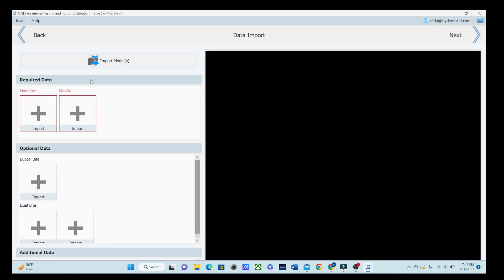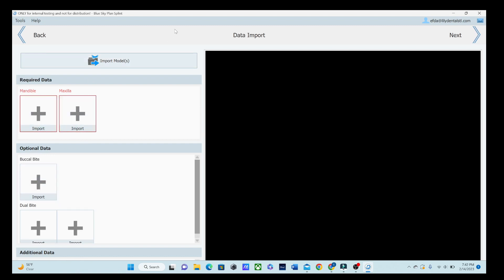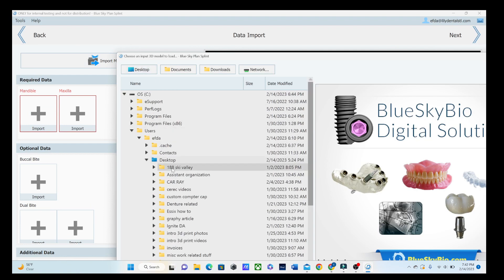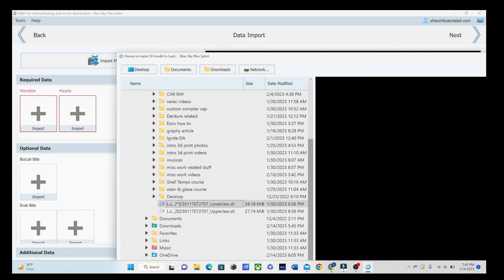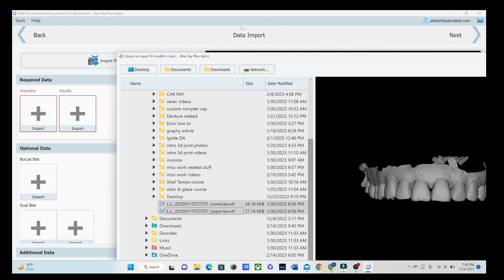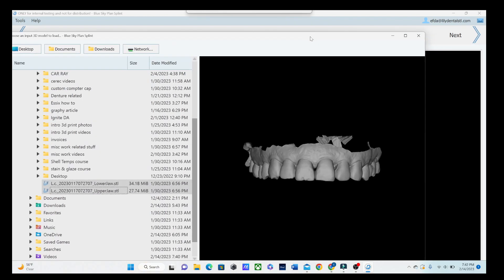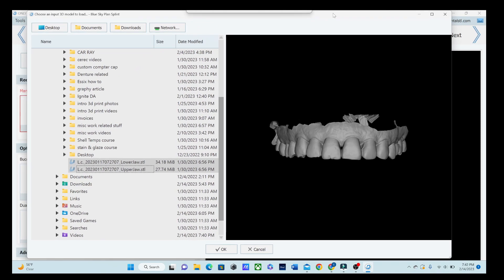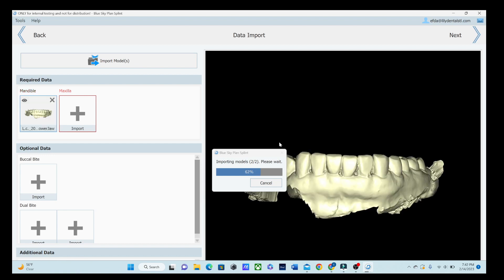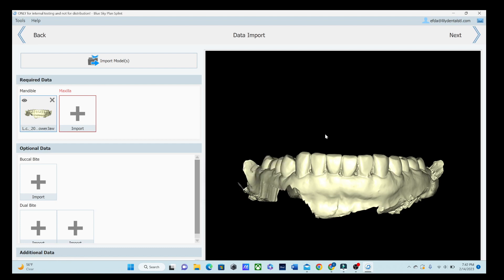We're going to import the models. This is kind of nice because it tells you what's required, and then you can upload optional data for a bite splint. We obviously don't need a lot. So let's just go import those files. My computer is being all difficult today. Open both of those.